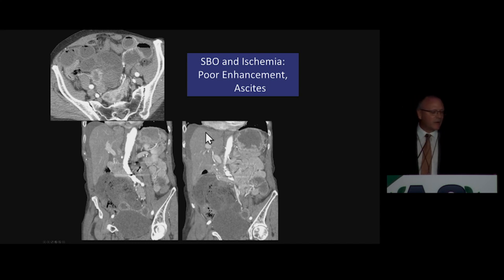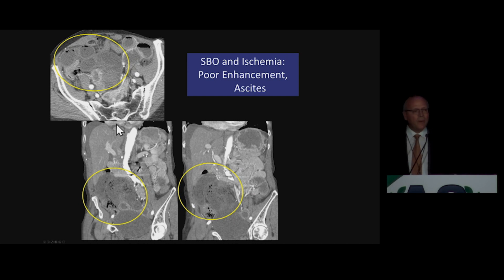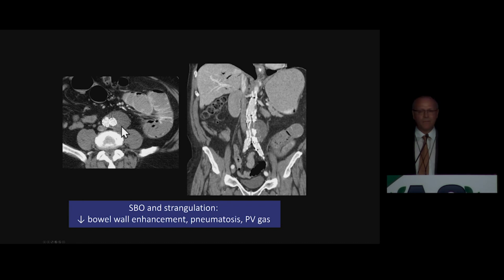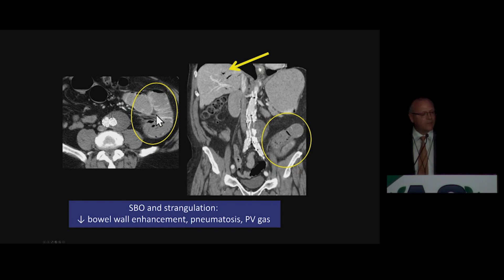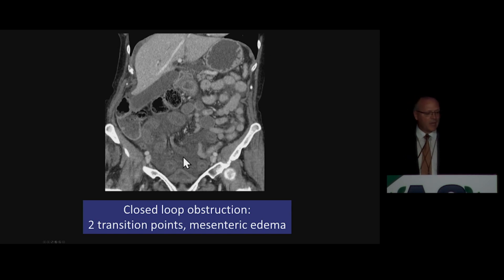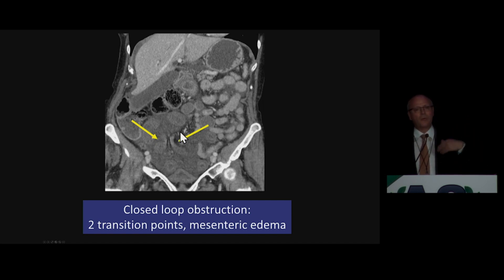A few examples of what you should be looking for. Yes, there is obstruction in this patient, but there are many signs of ischemia: the wall is thickened in the right lower quadrant, there is poor enhancement, and there is ascites. Ascites is a very ominous sign in the presence of bowel obstruction. Changes in enhancement: notice a transition from slightly hyper-enhancement to absent enhancement in the wall of this loop of small bowel, with edema in the mesentery and portal venous gas — all the signs we look for in ischemia and necrosis. Another patient with multiple thickened loops of bowel in the lower abdomen, dilated mesenteric edema, ascites, and the two transition points next to each other — a closed loop already with signs of ischemia and very likely necrosis.